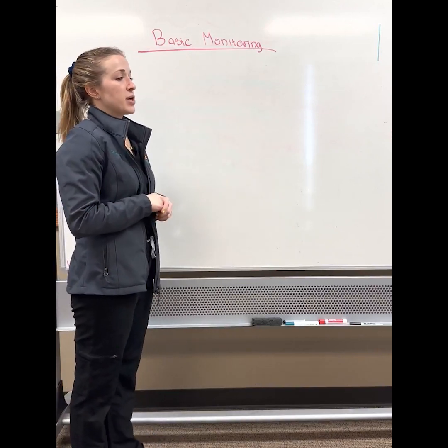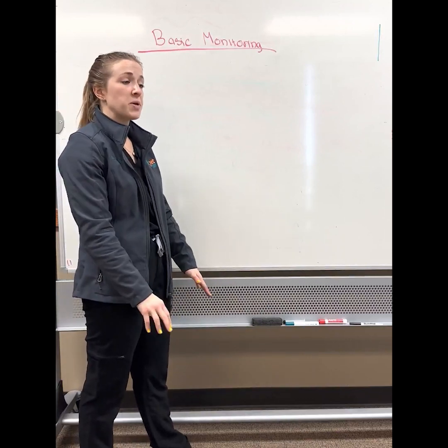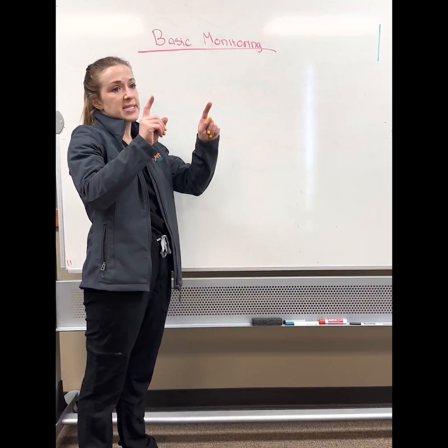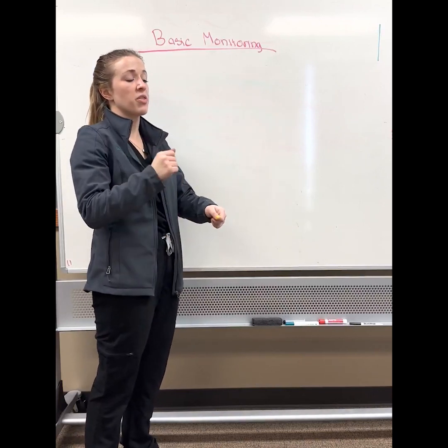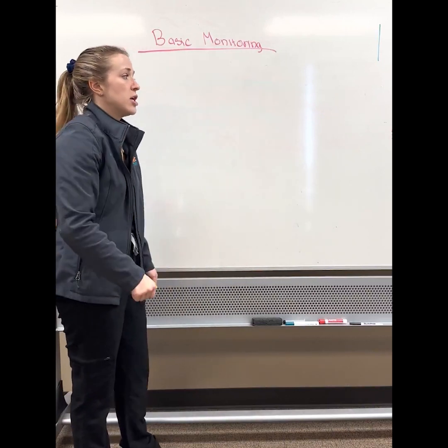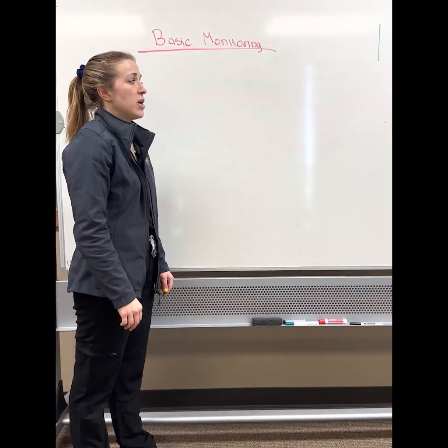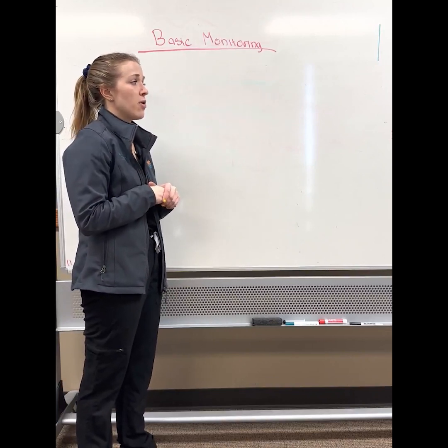My recommendation for caring for monitors is that when they're not being used, one of the feet on the bottom should be locked so that the monitor can't be rolled and hit something. I would recommend loosely coiling the cables, making 6 to 8 loops of 6 to 8 inches, and hanging them on the monitor with either Velcro or on the little hooks. Do not coil them really tightly so that they have tiny loops, because this frays electrical wires and then the equipment breaks. You should clean the ECG leads after use and make sure they're not jammed up with gel.